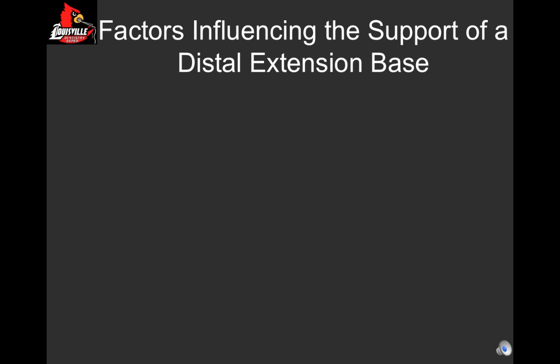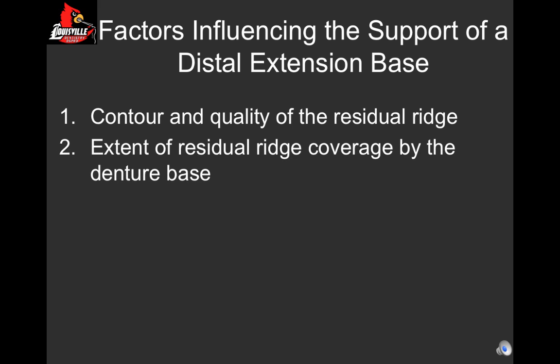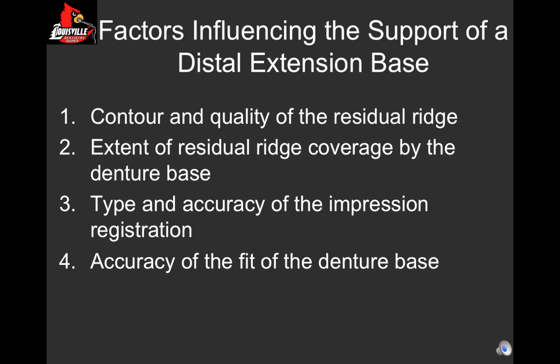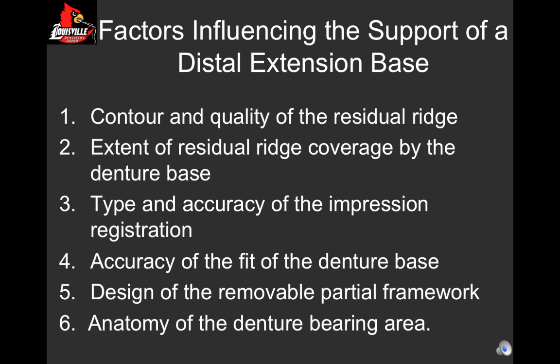There are factors influencing the support of an extension base RPD. They are: 1. Contour and quality of the residual ridge. 2. The extent of the residual ridge coverage by the denture base. 3. The type and accuracy of the impression registration. 4. The accuracy and fit of the denture base. 5. The design of the removable partial denture. And 6. The anatomy of the denture-bearing area.